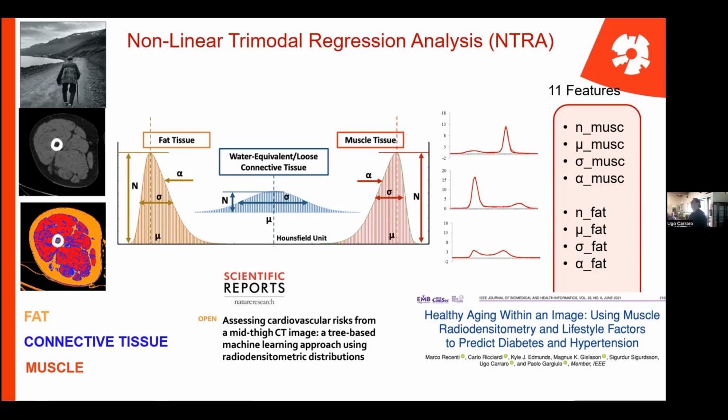The opposite is in people aging, where the fat is a lot greater and the muscle decreases. But here, it's something very interesting, because this is the pathological muscle. So in the pathological muscle, there is an expression that is very unique. It's not aging muscle, it's not atrophic muscle, it's something different. So this characterization was an inspiration to analyze this for all the people that are aging.